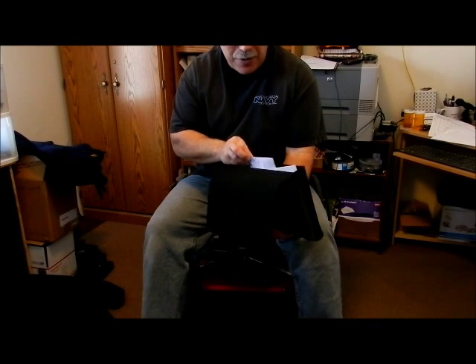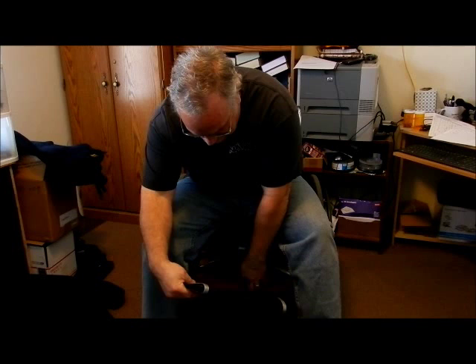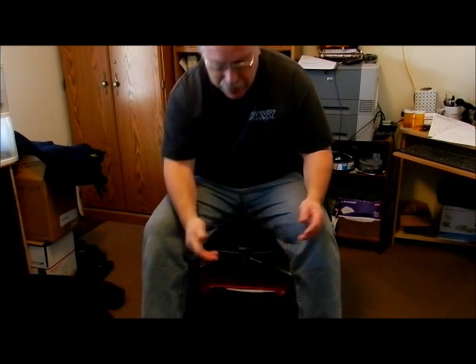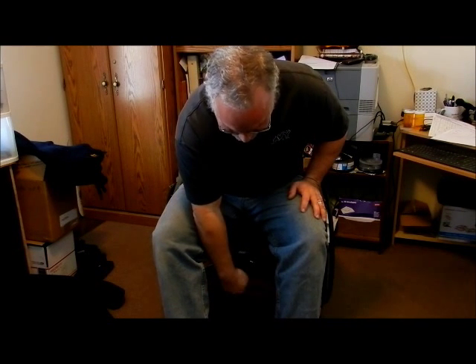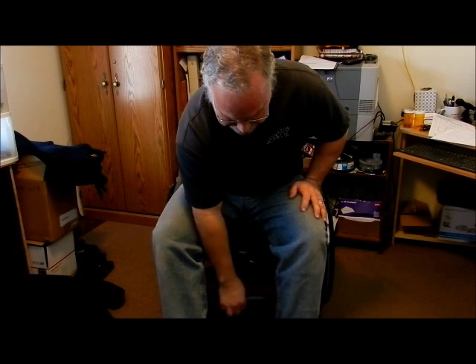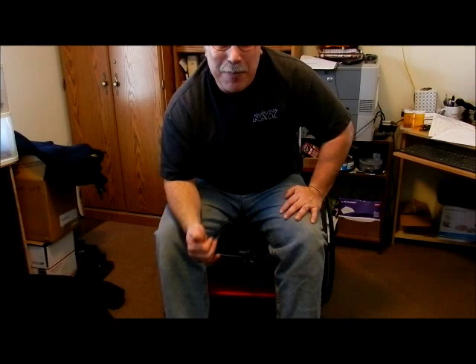My documents can go in here, things like that. Goes right down inside. And there it is. At no time is it on my lap and falling off every time I wheel around and so on. If I even wanted to, I could put a water bottle in there too. My documents would be clean because they're inside that. So hey, check out how I put this together.